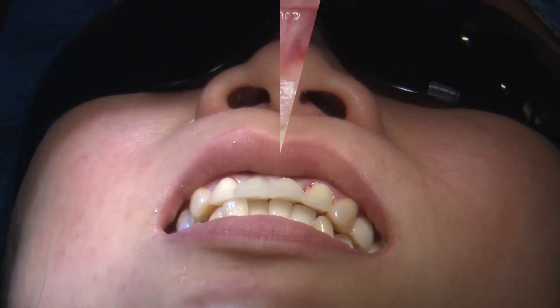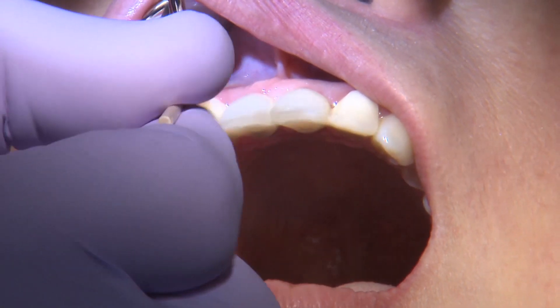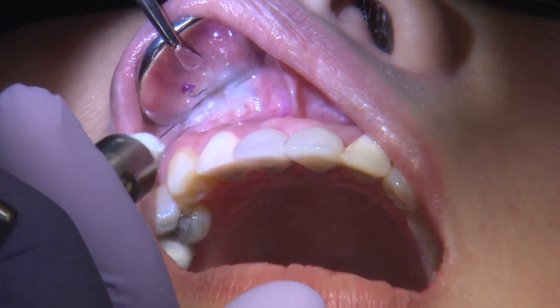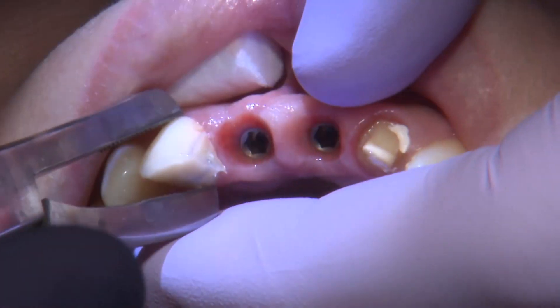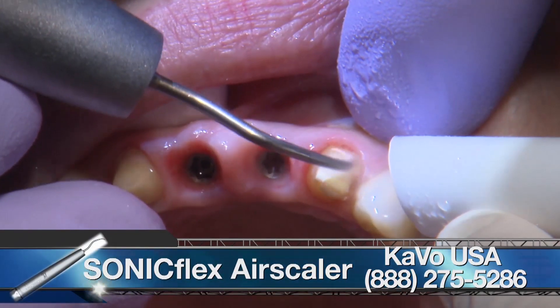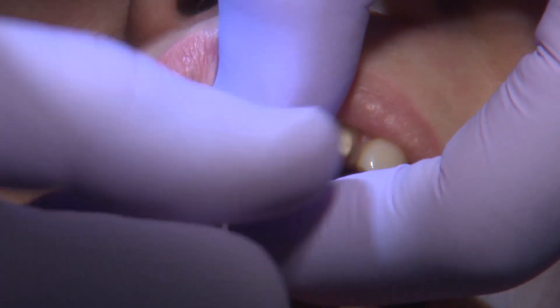As the patient returns after a few months, I remove the temporaries and evaluate the soft tissue to make sure it's where I want it to be. If I don't have proper contours, this is the stage where I can utilize the temporary to create the contours needed for the final restorations — and the gingival contour is really important for the final aesthetic result.